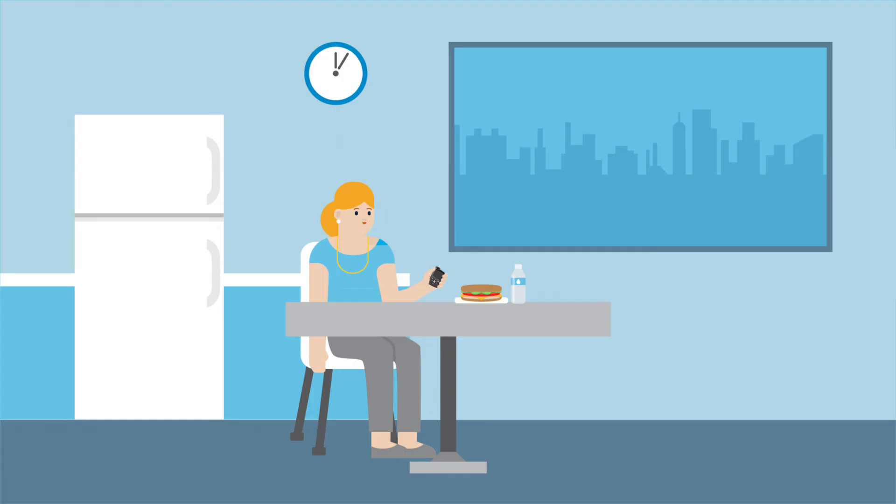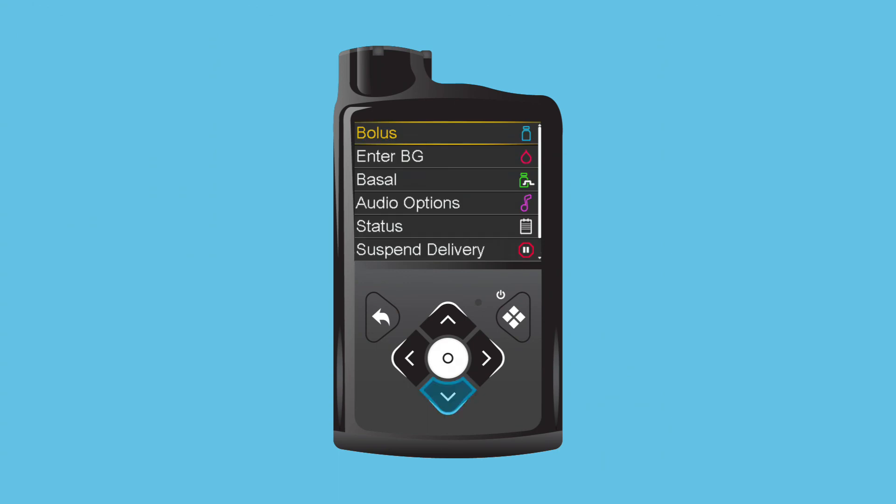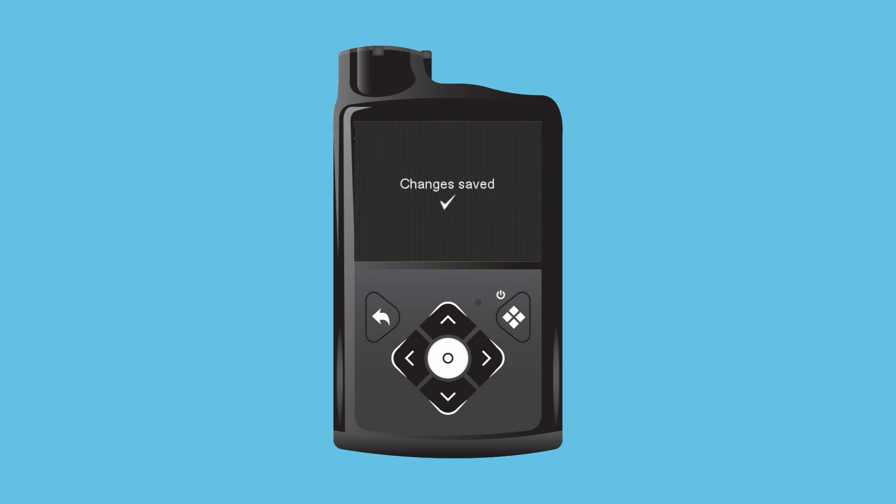Clara wants to practice navigating through the menus, so she decides to change her audio settings. From the home screen, Clara opens the main menu, scrolls to Audio Options, and presses Select. She scrolls down and selects Vibrate. A green light appears next to her selection, showing it is now turned on. Now she wants to adjust the volume of her pump. She scrolls down to Volume and presses Select. Using the arrows on her pump keypad, Clara raises the volume to Level 4 and presses Select again. She selects Save to keep her settings.